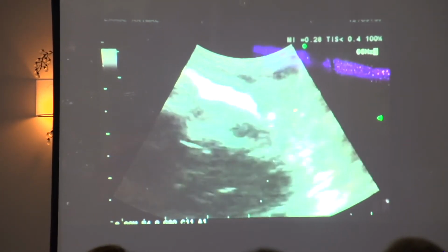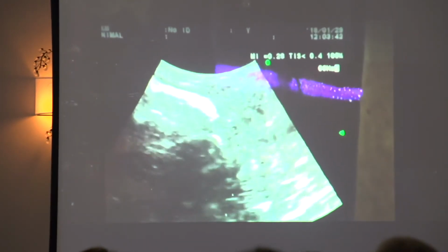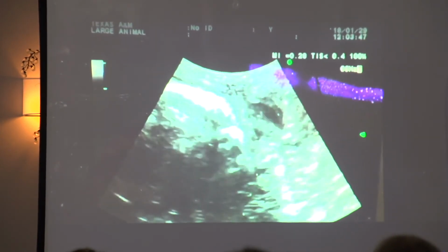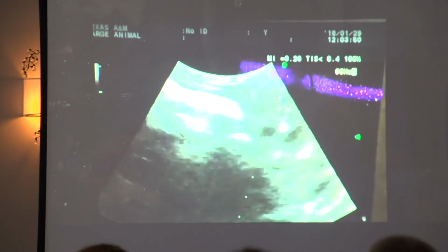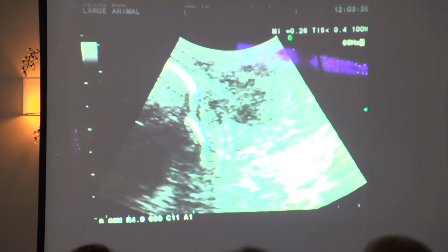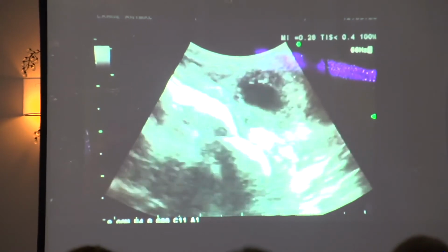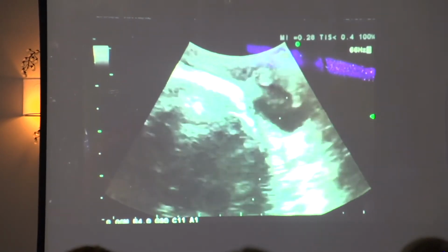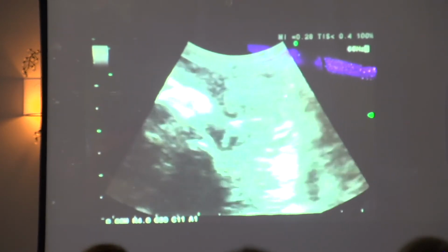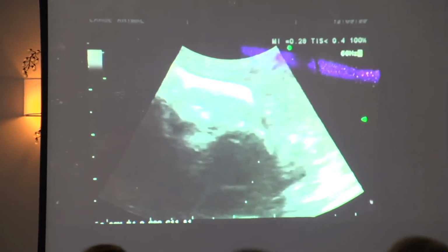But so that needle went into that follicle, aspirated that fluid, and you kind of see a lot of jostling going on right now. So what's happening is both the needle is being manipulated and also the ovary is being manipulated. And that's because we actually have to scrape the wall of the follicle in mares in order to acquire those oocytes. Whereas in cattle, it's much easier. Those oocytes are just free floating in the fluid, so really you just have to go in there, aspirate that fluid, and that's about it. What we have to do is scrape that follicle, place more fluid into the follicle to kind of make a very turbulent environment, so we hopefully can dislodge that oocyte and be able to aspirate that up.